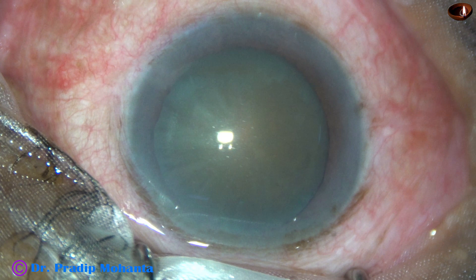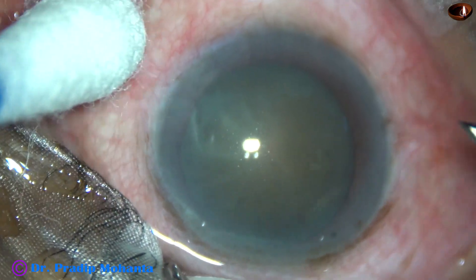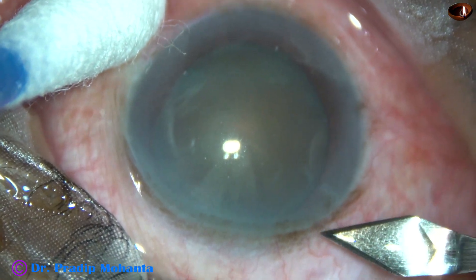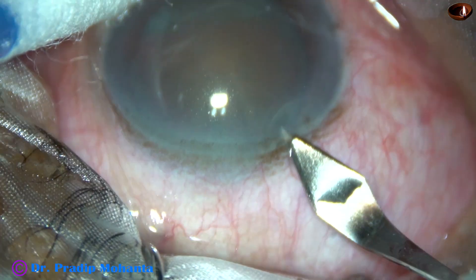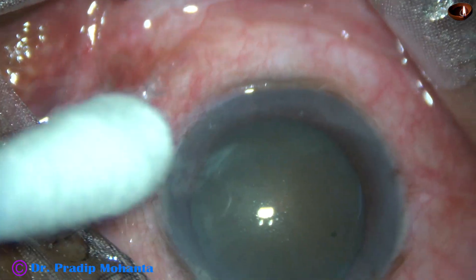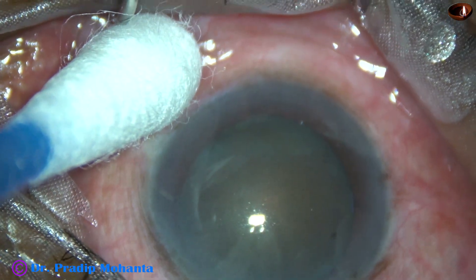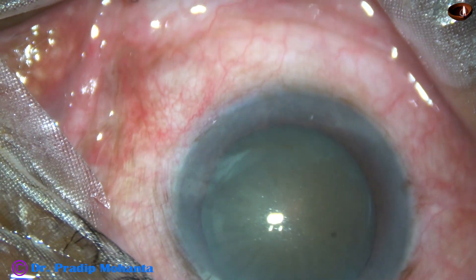This is an almost mature cataract. I say almost because I could see the optic nerve head and macula very faintly with indirect ophthalmoscope. The media was hazy, but still I could make out that there is a white scar over the macula.